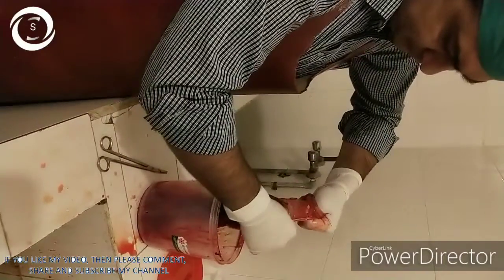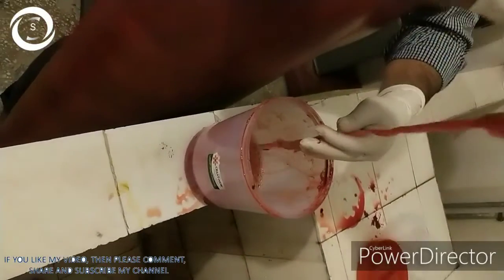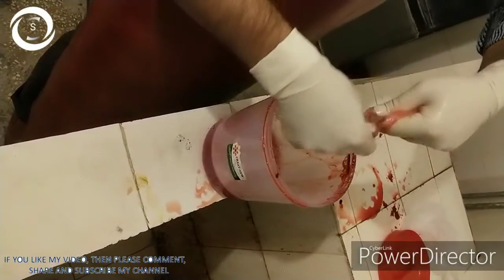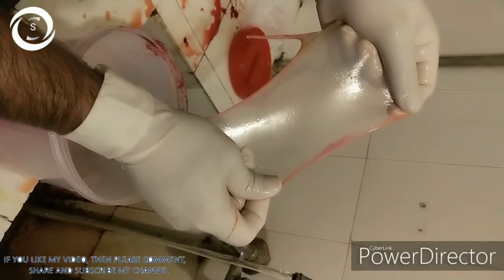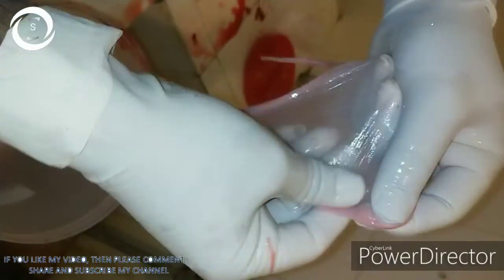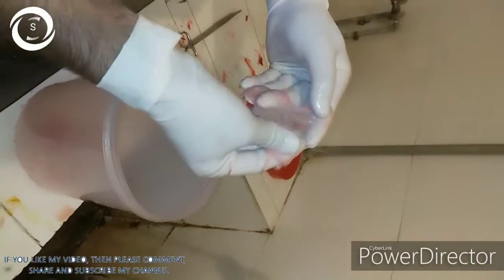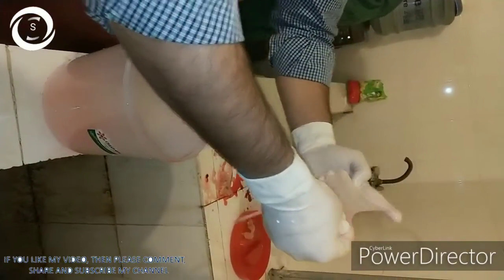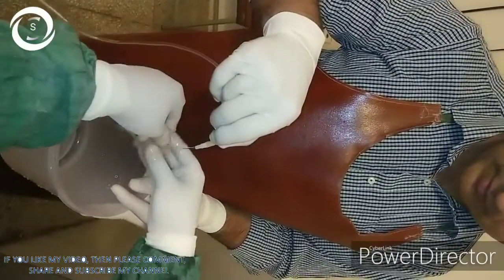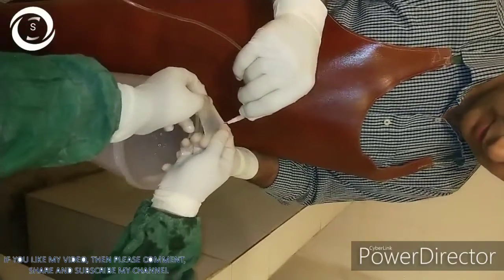You can see we have retrieved the amniotic membrane successfully from the placental tissue. Now clean the amniotic membrane with balanced salt solution. You should also put gram-positive covering antibiotic injection, gram-negative and antifungal injection into the jar containing the amniotic membrane.